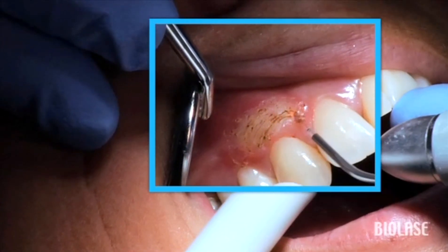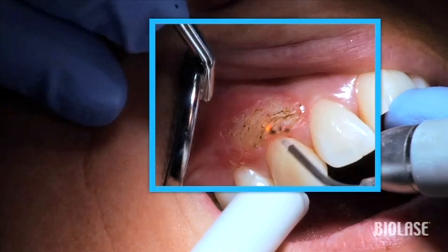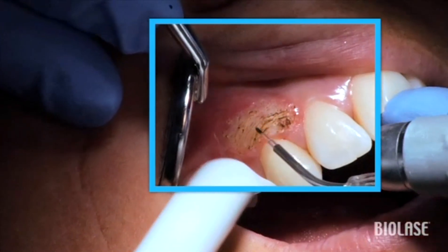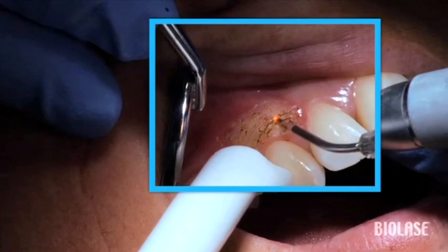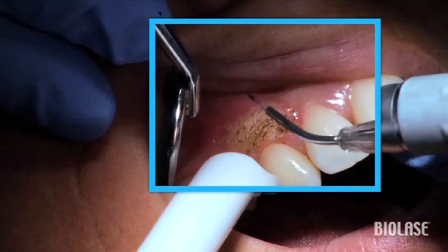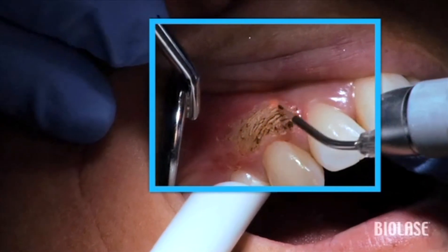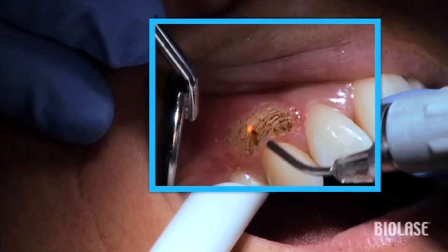As you do more of these procedures, you will learn what settings work best in your hands and how to evaluate each patient's tissue type and thickness, and how both speed and position of the laser tip in relation to the tissue all have an effect on laser performance. Use a light painting stroke to thin out the tissue layer by layer.